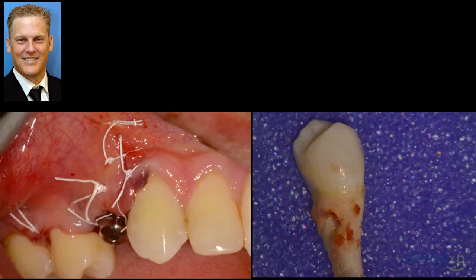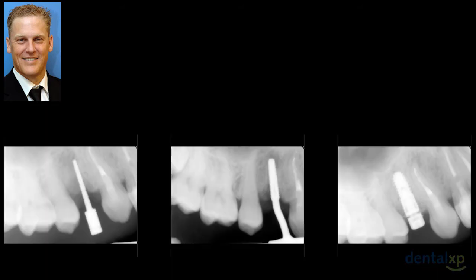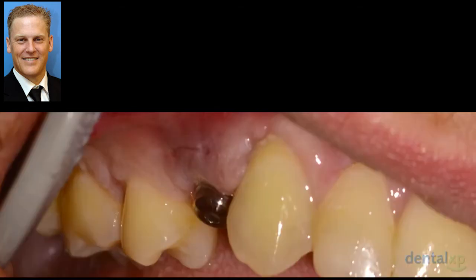You can see the tremendous external resorption that occurred and how far down the root it was, and how wonderful cone beams are for showing us these lesions and determining before we do the surgery whether the tooth is restorable or not. And in this case, obviously, it wasn't. The case is ongoing. You can see the placement of the implant on the right-hand side with the membrane in place, hence the healing cap is not all the way seated because there has to be a space there. And here's a 2-week healing in this ongoing case.